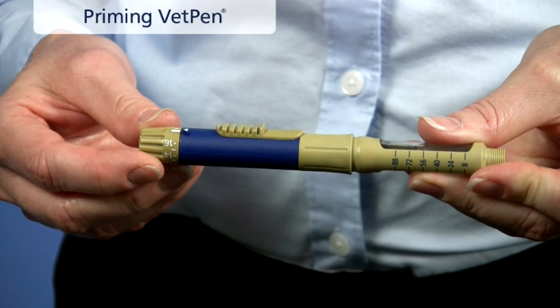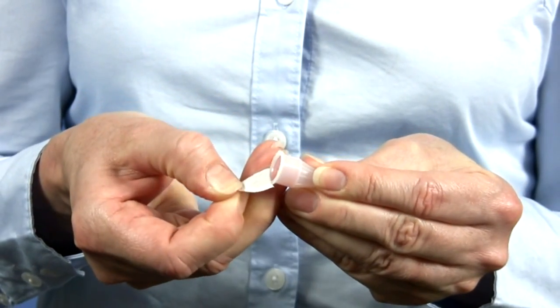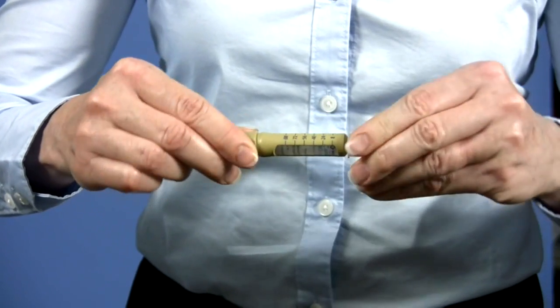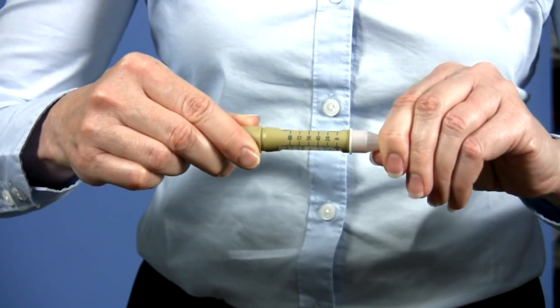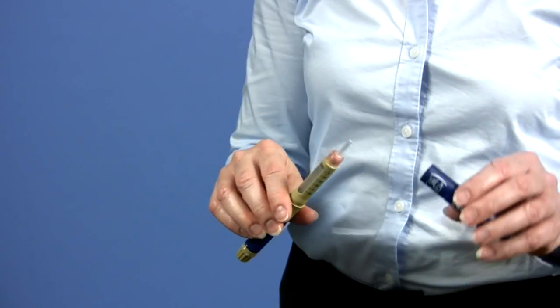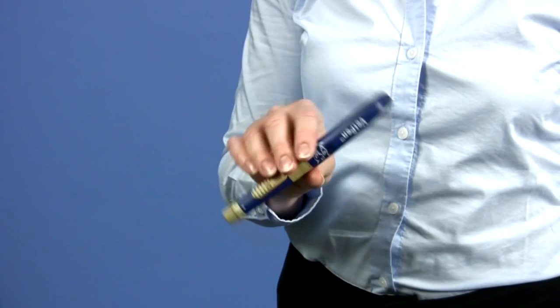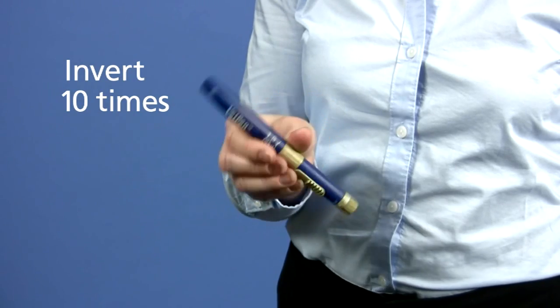Before you prepare the first insulin dose, you need to prime VetPen to remove air from the cartridge and ensure it works properly. Take a new needle and peel off the protective film. Screw the needle onto VetPen and remove the outer protective needle cap from the needle. Replace the VetPen cap to cover the needle. Now, mix the insulin by turning VetPen up and down at least 10 times.